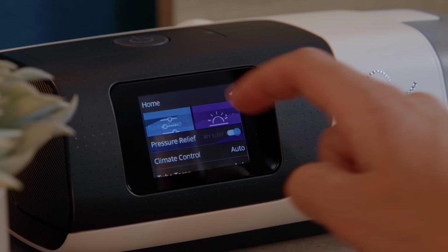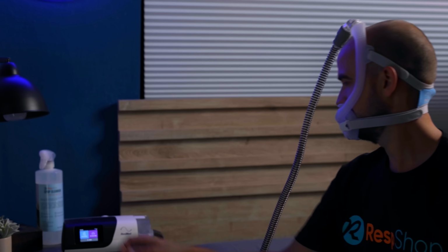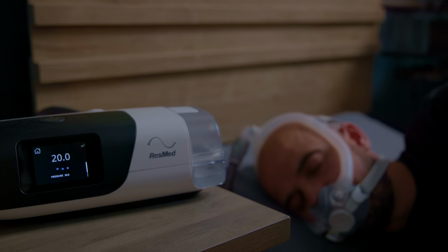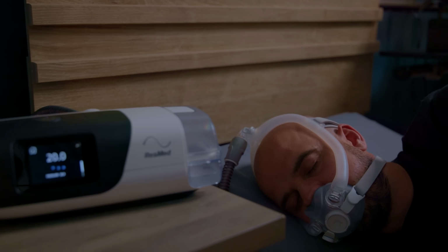The next option is also available in the usual My Options menu. It's called Ramp Time. Ramp is a feature that allows your therapy pressure to start low when you first go to bed and then ramp up to your prescription level once you drop to sleep. The reason people like to use Ramp is so that the pressure is less strong and less intrusive while you're trying to go to sleep, and you don't need the pressure at your therapy level.